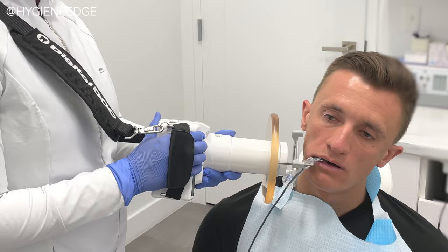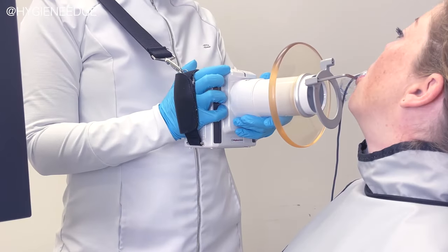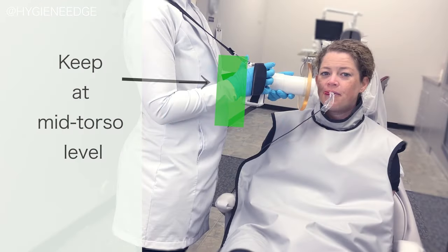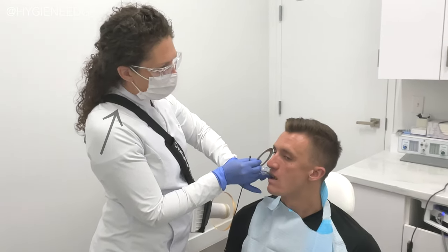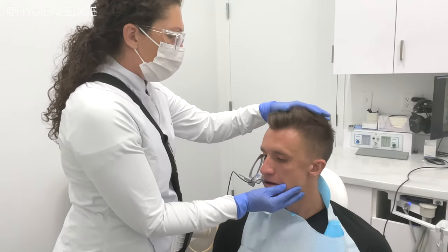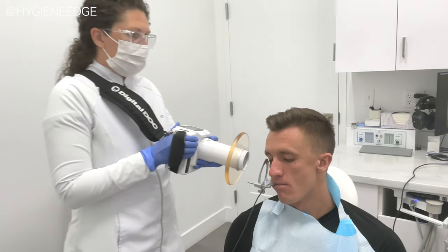The first thing to know about is the backscatter shield. This is an important part of the handheld unit, like this FDA-approved XTG from DigitalDoc. Research shows that with the geometry and angles of scatter radiation, you'll be safe by keeping the unit parallel at your mid-torso level. This is called the zone of significant occupancy. The adjustable strap keeps the unit secured in the right spot and more ergonomic, so you won't have to set it down every time you adjust the sensor, which reduces operator fatigue.